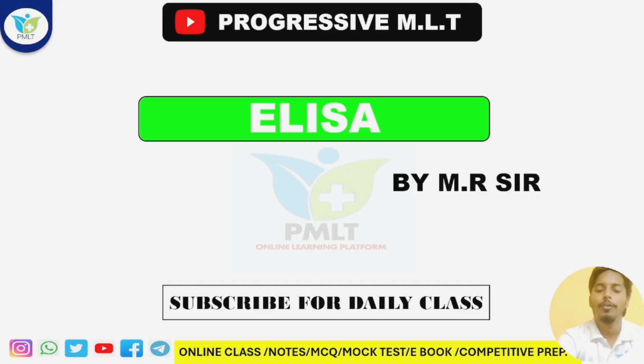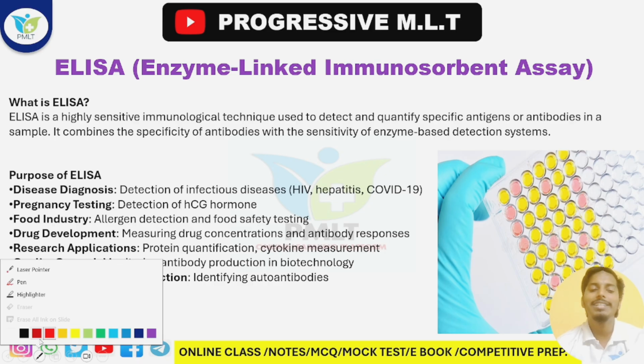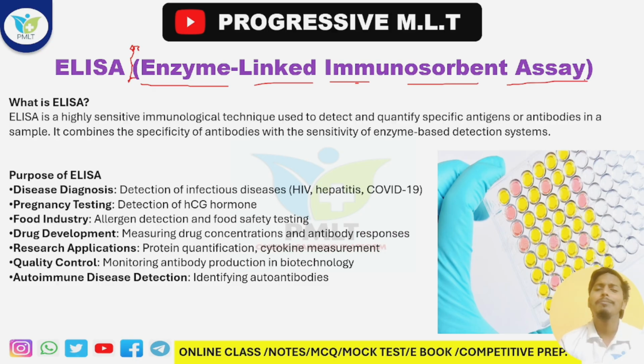Okay, without any delay, we are starting the ELISA, that is enzyme linked immunosorbent assay. I keep repeating this because the real answer of the ELISA is in the name: enzyme linked immunosorbent assay. I'm using very simple English so that you can easily understand, whether you are Hindi medium, Bengali medium, or another medium.